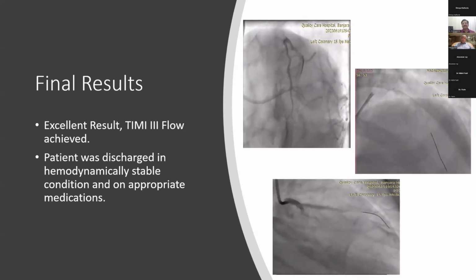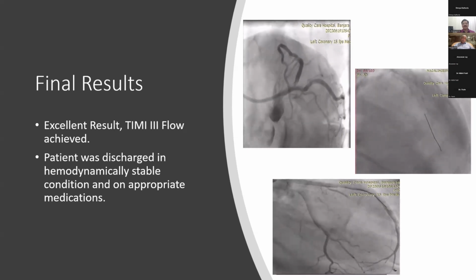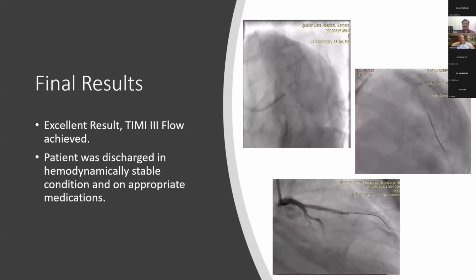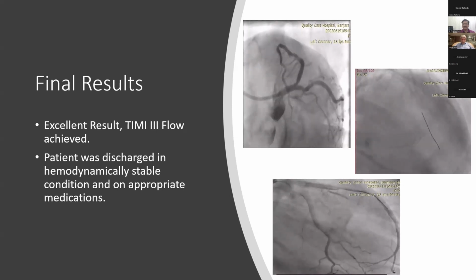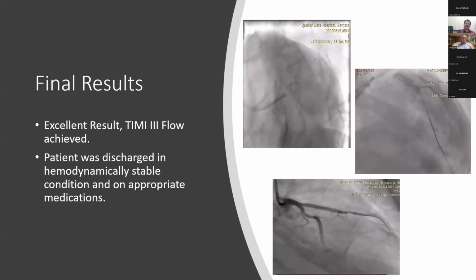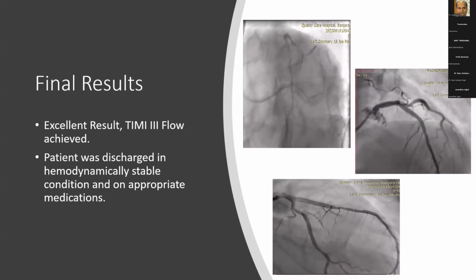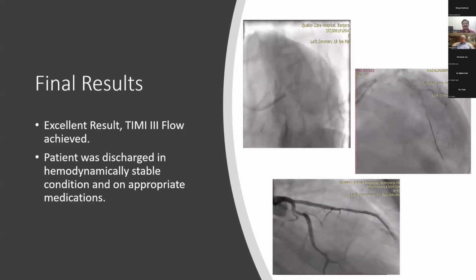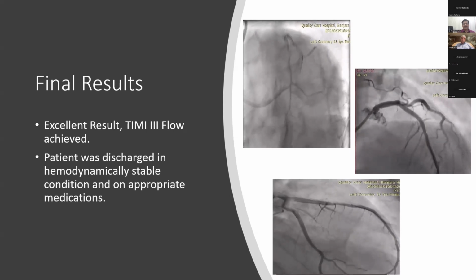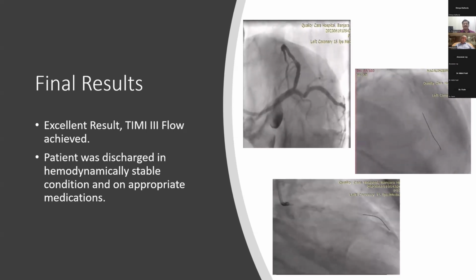So once there is a balloon crossable lesion and heavy calcium, both by means of CT angiogram as well as fluoro, we did the systematic preparation by means of a routine balloon to facilitate IVL, which is an aggressive calcific modification tool which causes disruption by microfractures, with ultimately good stent expansion and apposition, and with post-dilatation a very good result, to prevent both acute and long-term stent failure, preventing stent break.